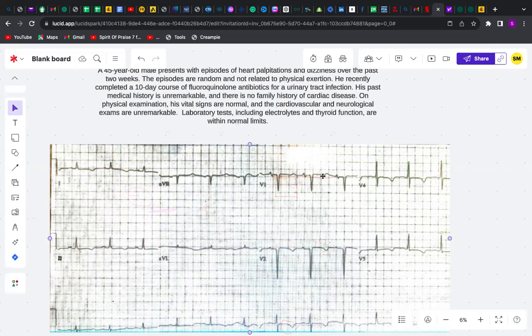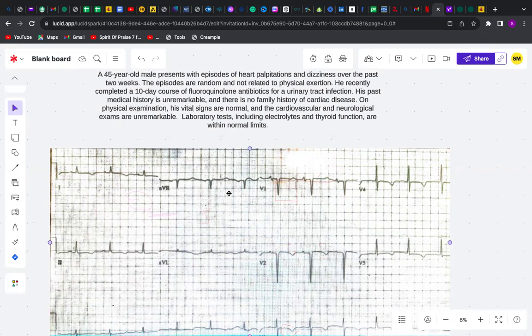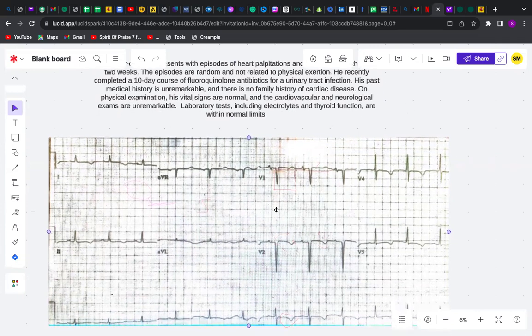Actually, for the septal MI, even based on the age, we were really in doubt. Okay, so it could be or could not be. But this was just a physical examination. The labs show that the thyroid function was normal, but we just read that in hypothyroidism the QT could also be prolonged.